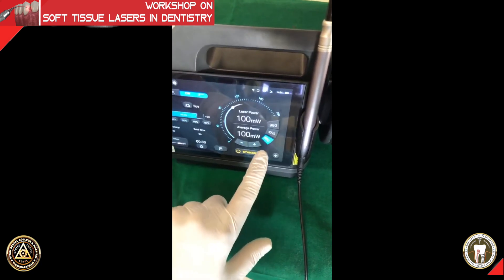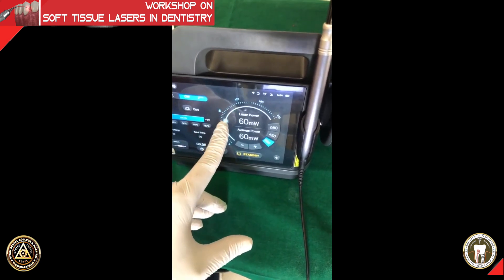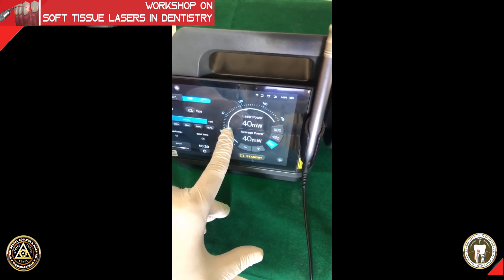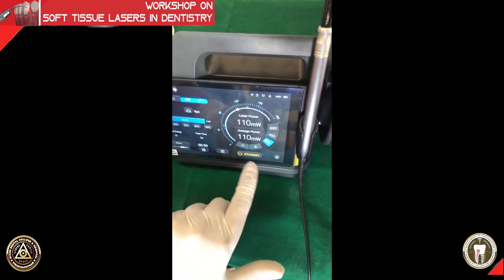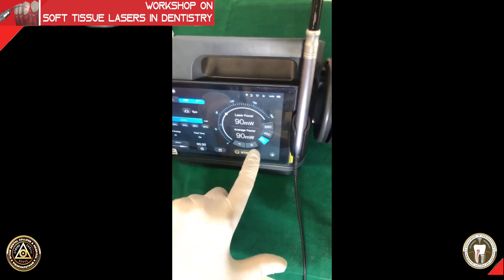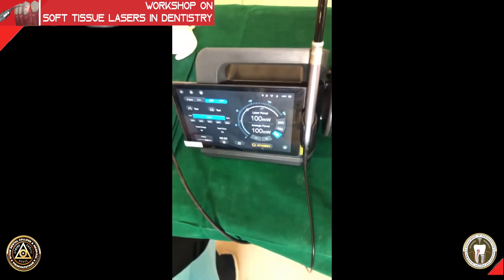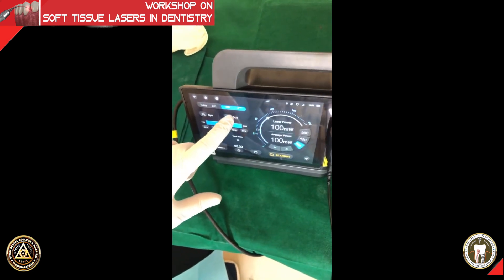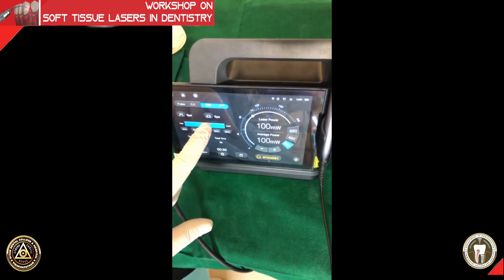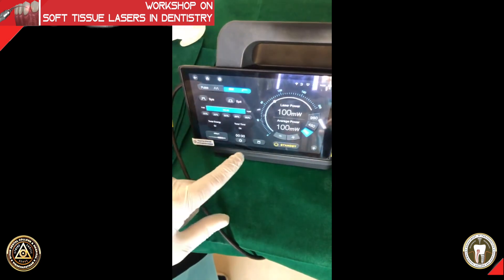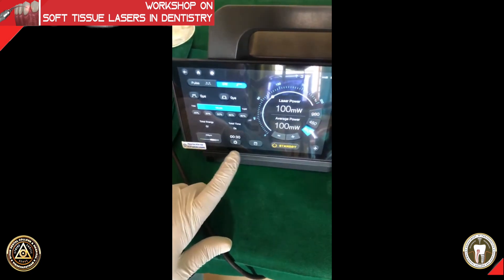If you have a machine with a 650 or 660 nm option, you have options to reduce power a little more. As per the literature, you can use 75 or 100 milliwatt for photodynamic therapy — remember it is in milliwatt, not watts. We are using a continuous wave mode of operation at 100 milliwatt.